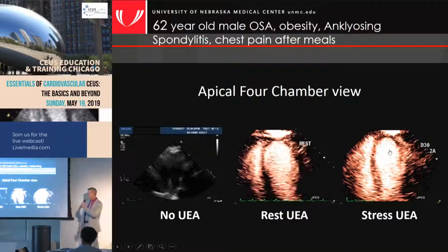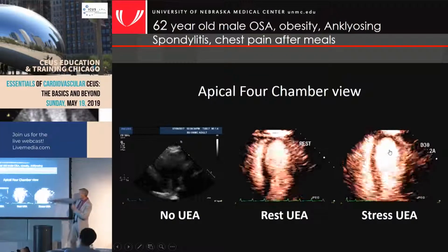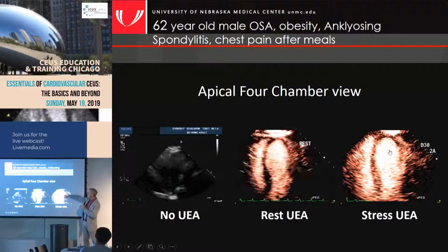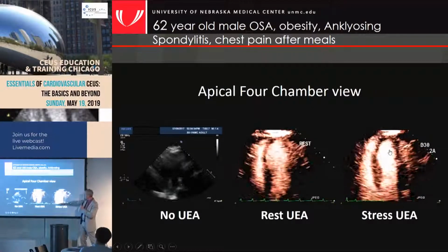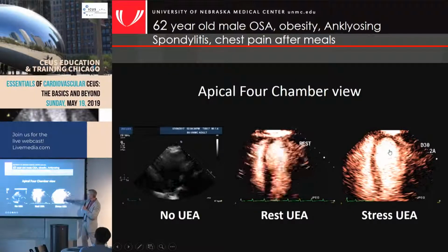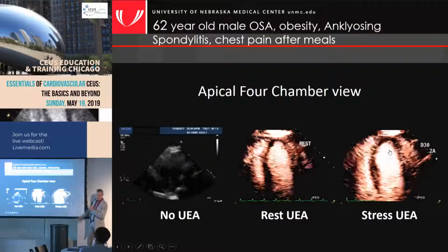Yeah, I wanted to make sure there wasn't anything with that very low MI, that there's no focus or you change that. This is a good point, because if the focus is up here, then that 0.18 MI is going to be here, and then it'll drop off considerably here. So you want to keep that focus about right here at the mitral valve level, or even a little lower if you want, so that the MI reaches its maximum here. So you're getting penetration all the way down.